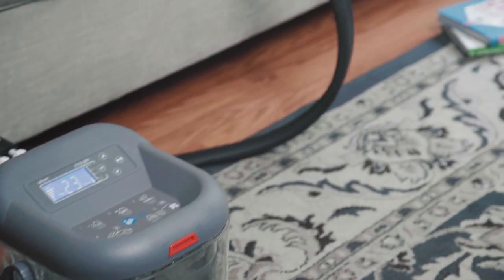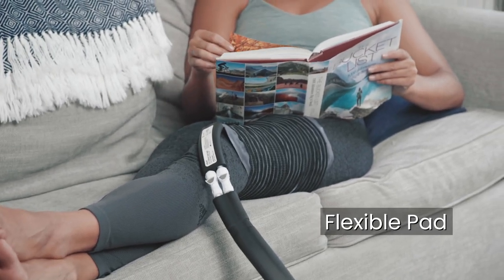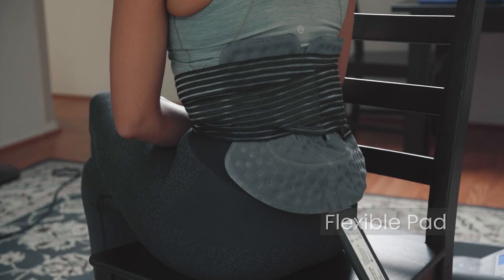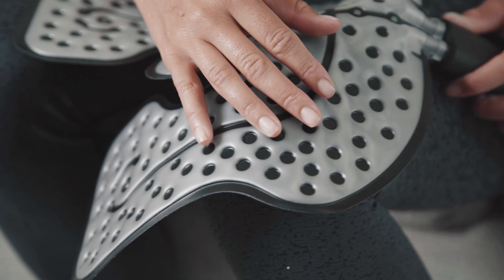It effectively targets multiple muscle groups with its large, flexible pad. Use on your legs, shoulders, arms, hips, knees, and lower back. The surface of the pad is also dimpled to ensure the ice water is evenly distributed.